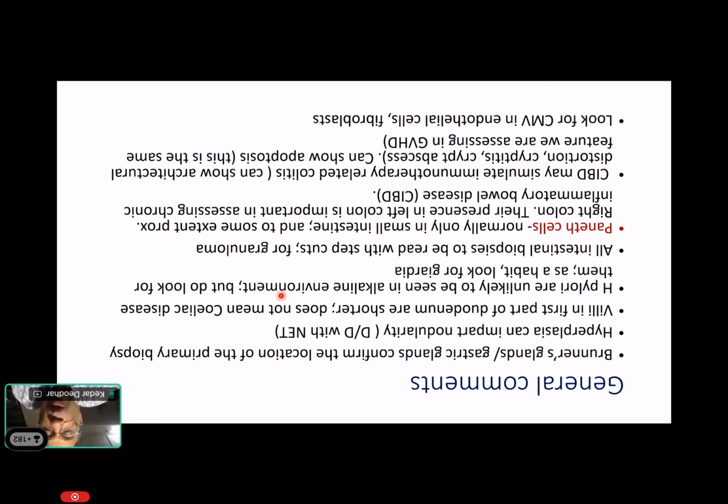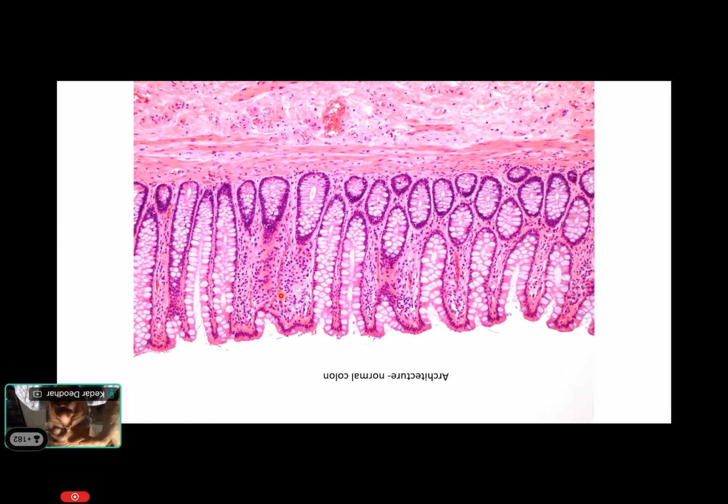So in normal colon, we have the mucosa, which is typically described as having test tube-like features. The crypts are arranged parallel to each other, and this is actually the normal appearance. When it is disturbed or we have bifid or branching crypts, then we call it architectural distortion.